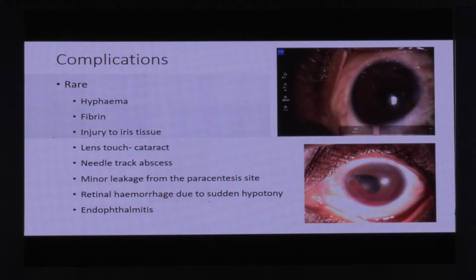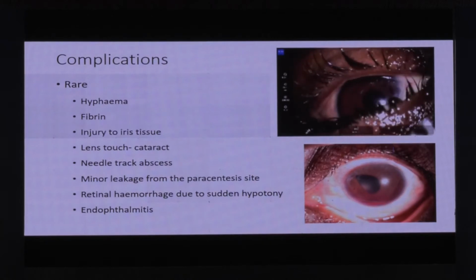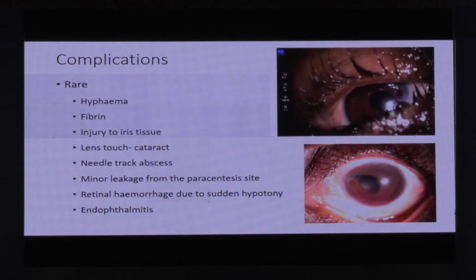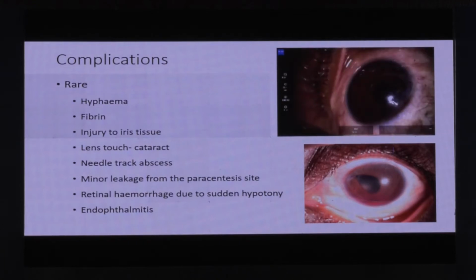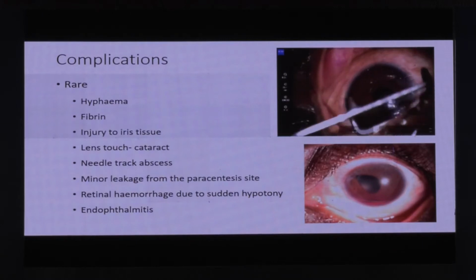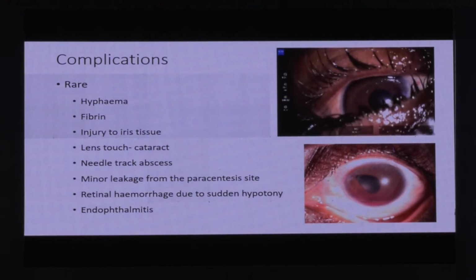Now, it is a relatively safe procedure, done in experts' hands, but you still need to be careful. Complications are very rare, and the most common is hyphema. This is a video which shows that many of these cases also have new blood vessels in the angle. So when you tap the eye, because of the sudden change in pressure, you can see a bleed coming in. This is the Amsler's sign. So you can also see hyphema in some cases 1 day post the tap.